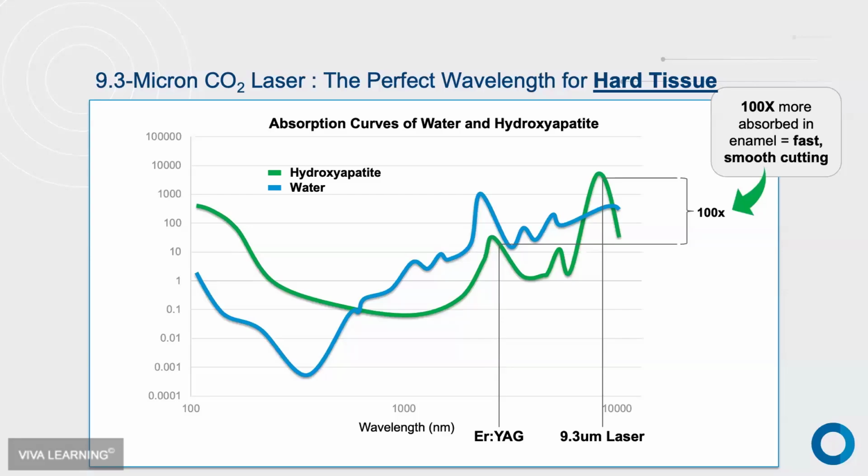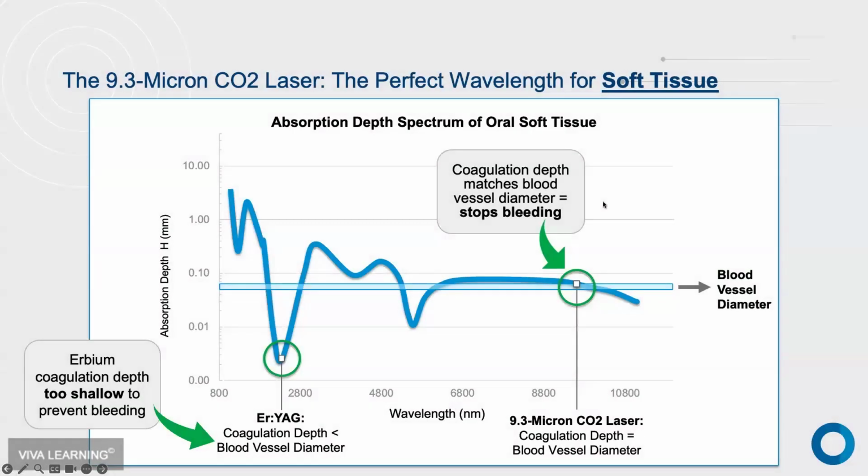Now, one of the best things about this is that when it cuts, there's no bleeding involved. So how does that happen? Well, one of the other things about the laser is that essentially it goes just deep enough, the absorption into that tissue is just deep enough that it actually absorbs into collagen and the collagen actually contracts. So imagine cutting a straight line through tissue, and on either side of the cut, collagen is shrinking down and closing off blood vessels and lymph vessels to create more of a coagulation effect, which then keeps the blood from just basically bleeding during the procedure.